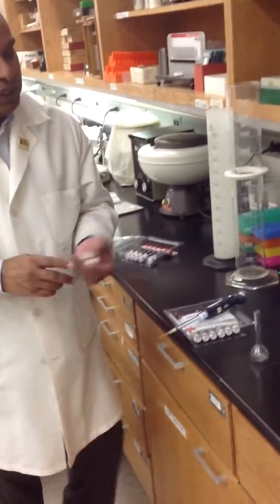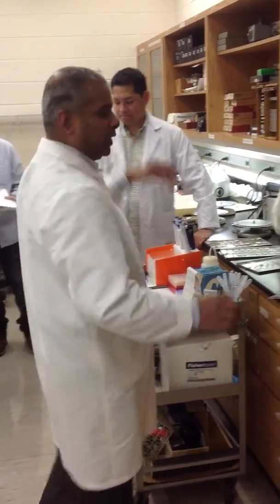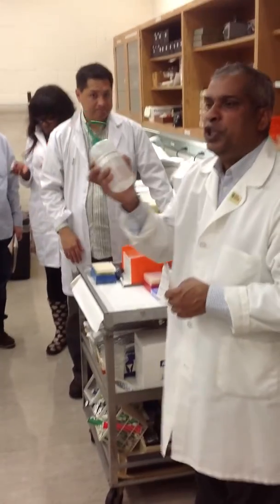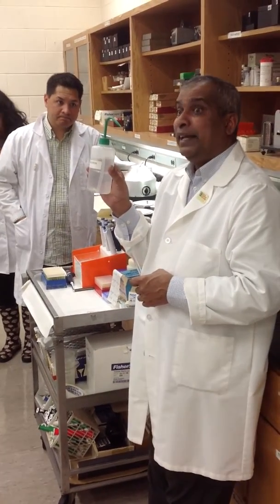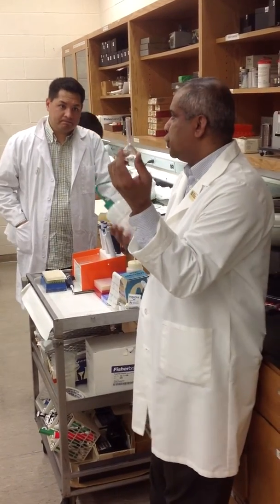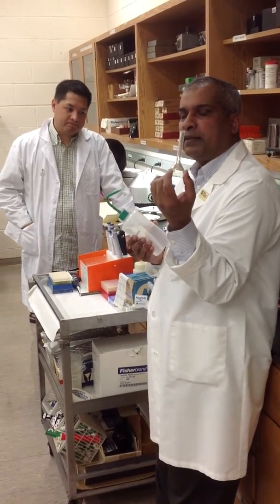So to make up our solution, right, we need the blood. I'm going to make sure, here you guys can mix it as you go, because they're sitting in the refrigerator. So when we do RBC, we need what? Saline. What happens if we use water to make up our dilution? Water will do what to red cells?